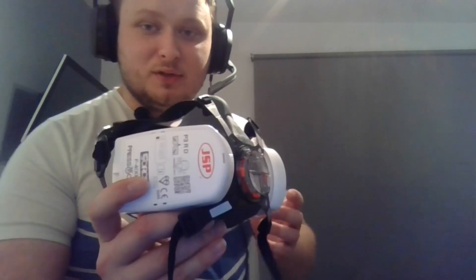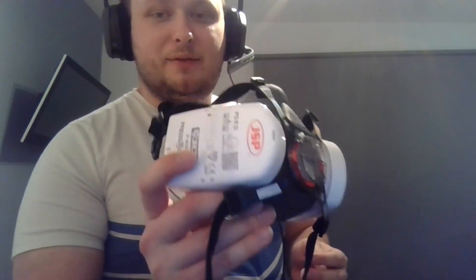Hi everyone, AlphaReddit here. I'm going to do a quick video today on a respirator I recommend for dealing with the coronavirus. Here it is — the JSP Force 8. This respirator is perfect if you've got any dusty jobs around the house, and also for keeping coronaviruses and other flu viruses out of your respiratory system.